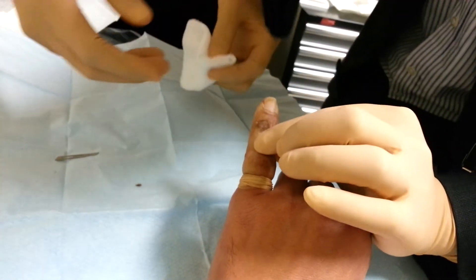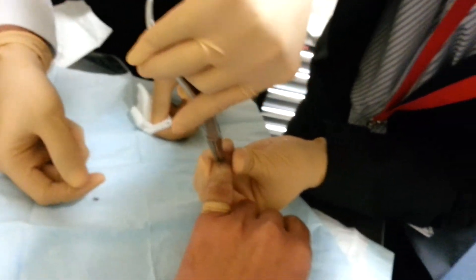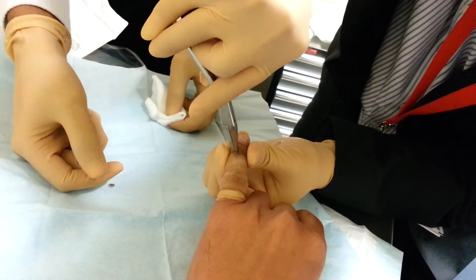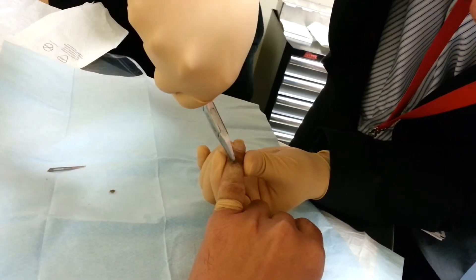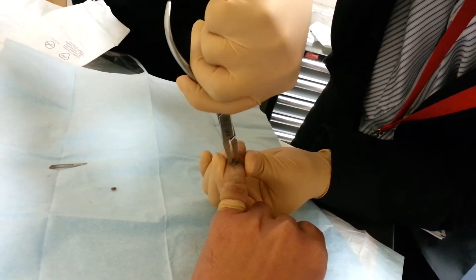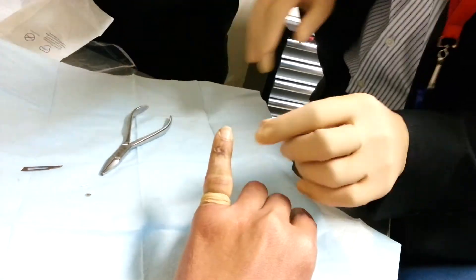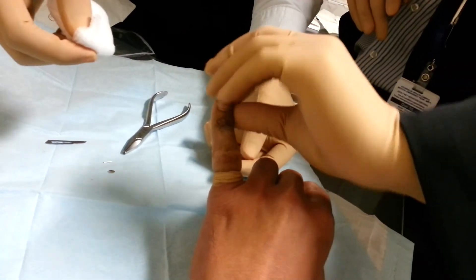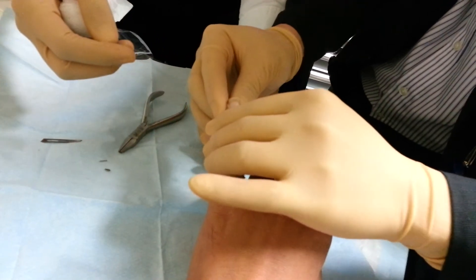You see that at the base? It's right there. I find a lot of these by you. There we go. There's one. It's a bit harder to feel. Some right here, some right here.